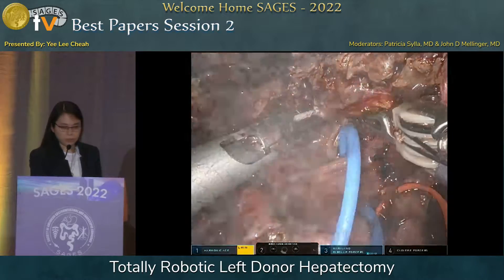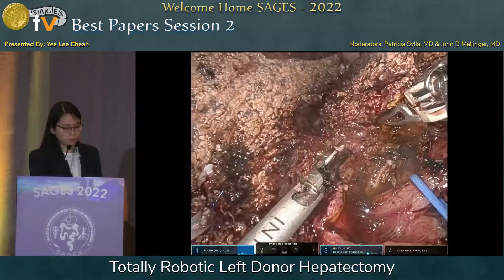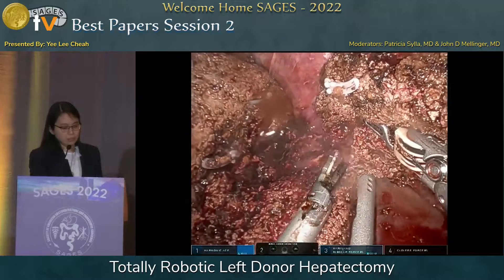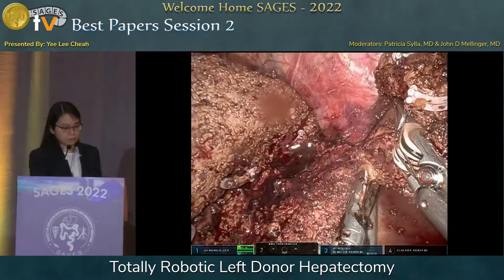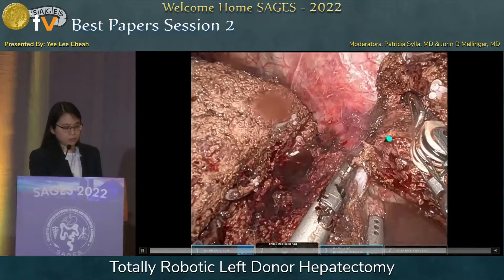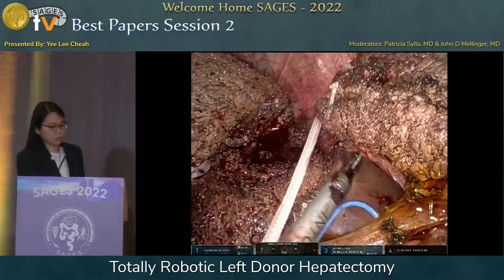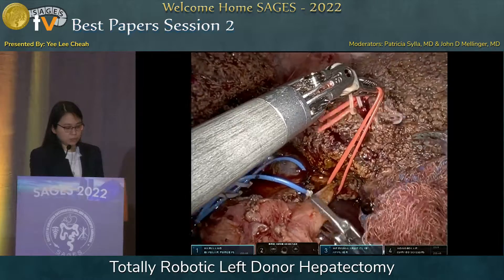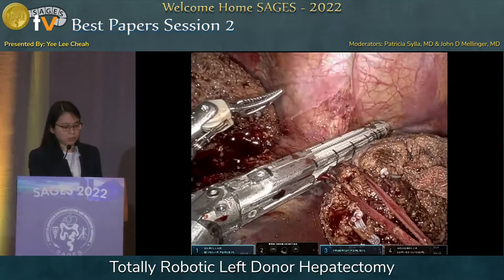From a vertical plane, we now change the transection plane to a horizontal plane to separate the left lobe from the caudate lobe. We proceed from the hilum all the way superiorly until we meet our previously dissected left and middle hepatic vein area. You can just see the middle hepatic vein here — we are almost there. Once at the area of the veins, they are encircled with umbilical tape. The patient is now heparinized in preparation for graft retrieval. The artery is clipped and transected — this is the cross-clamp time. The portal vein is transected with a stapler, and so are the middle and left hepatic veins.